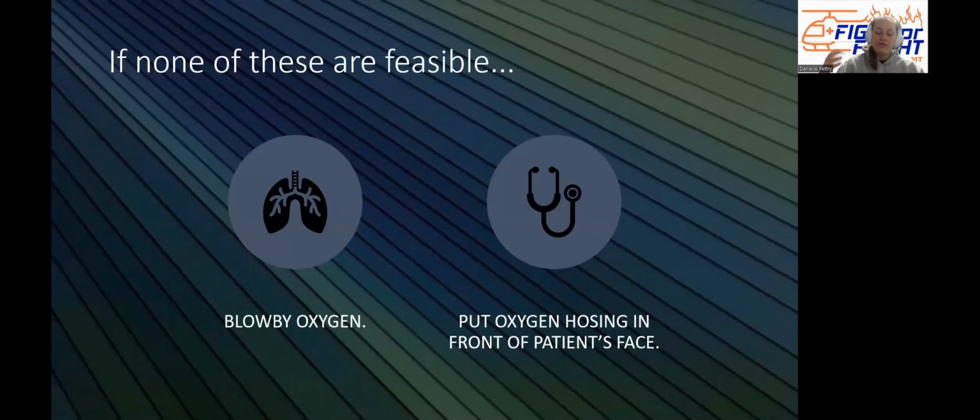Okay. Now, if you can't do any of these things, if maybe there's a child patient and they're not tolerating a nasal cannula or non-rebreather or a BVM, if we have to use that, we just have to. But if the nasal cannula and the non-rebreather aren't working for somebody, we always have blow-by oxygen. That's another option. You can just take the hose right off of the non-rebreather and put that basically in front of their face, just so they're getting a little bit better than room air. A little bit of oxygen is going to be better than no oxygen.